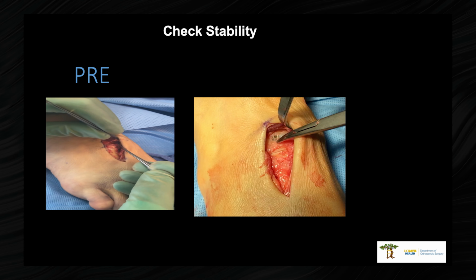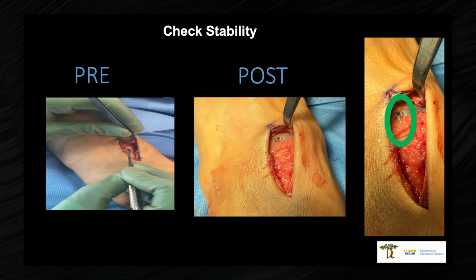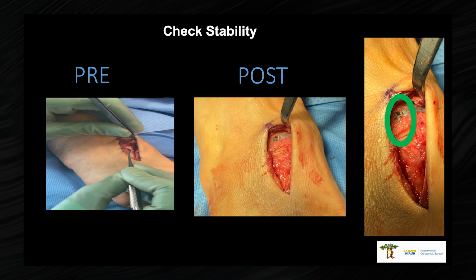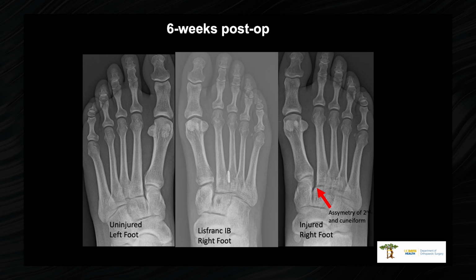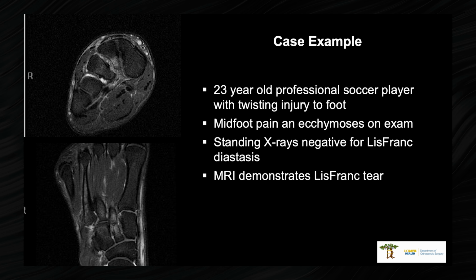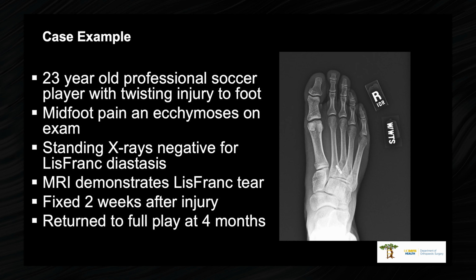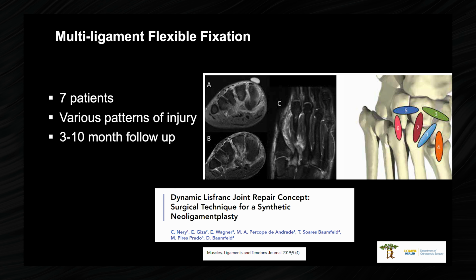And there's the pre. You can see that instability, post, and it even stabilizes the second TMT joint. So that's the final construct. Looks good. This was one of our professional soccer players here in Sacramento. And you can see the edema all the way through. And then he got back at about 4 months. And then when he was retiring, we got an exit MRI at 12 months, and you can see the reconstitution of the ligament there.